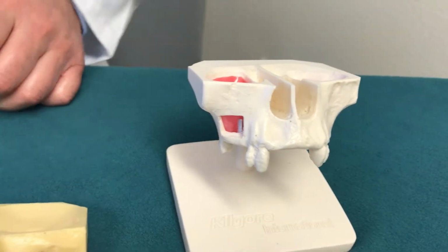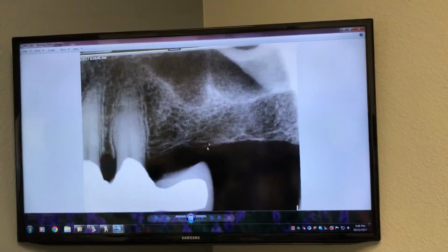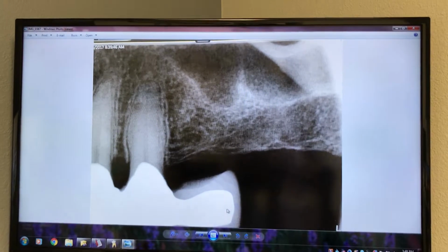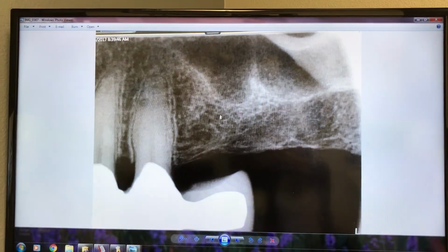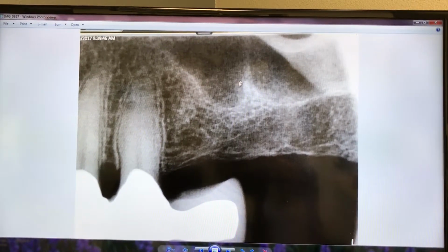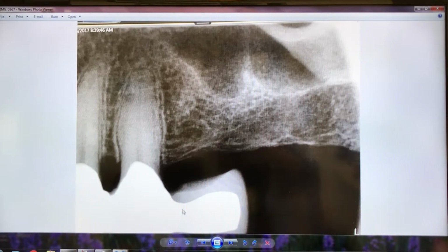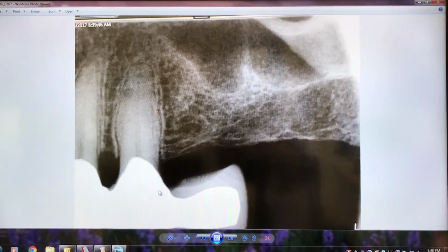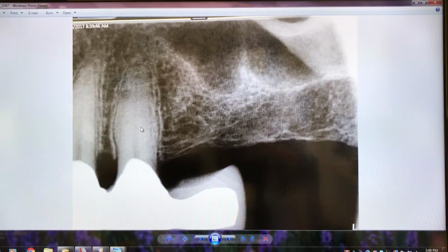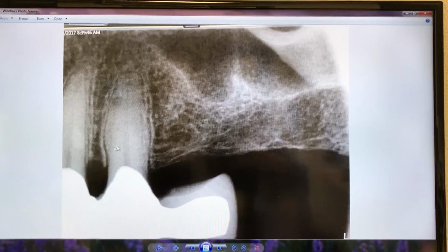Now, if I were to show it to you on an actual patient, you see this patient came in, had this cantilever bridge because there was not enough bone here before it reached the floor of the sinus to place the implant. So what we did, we cut this back portion of the cantilever bridge, which was putting a lot of pressure on these two teeth, by the way, and it would make them fail.